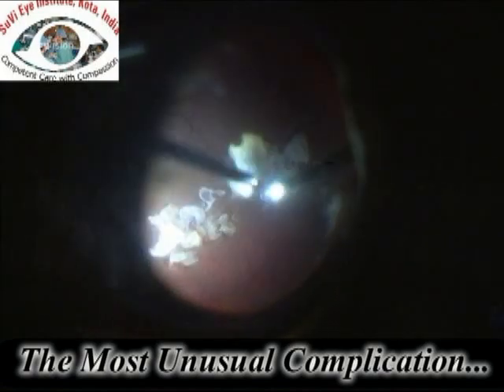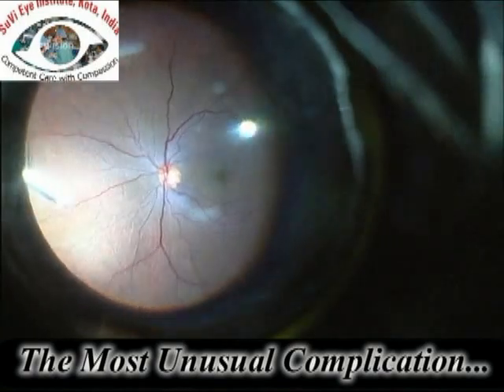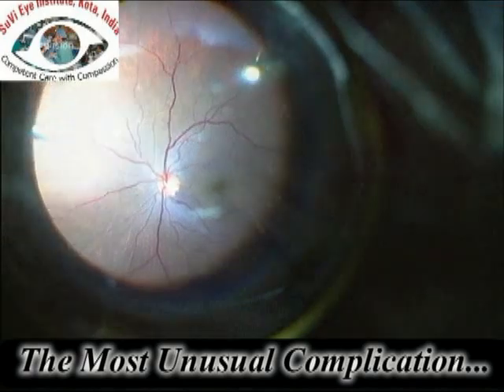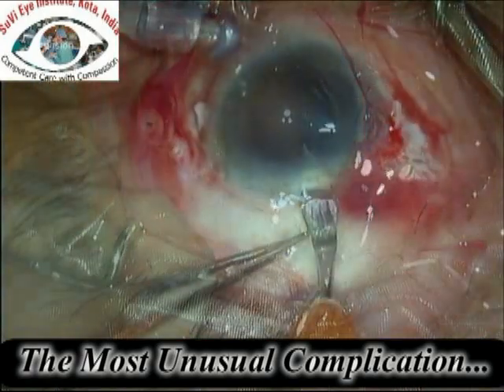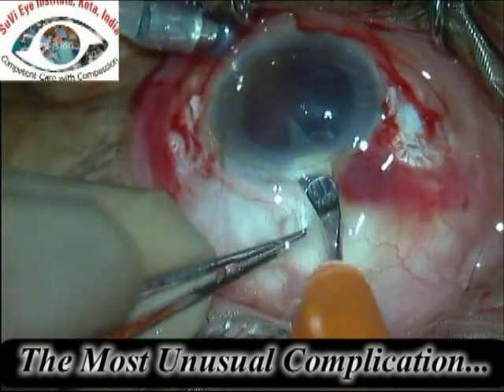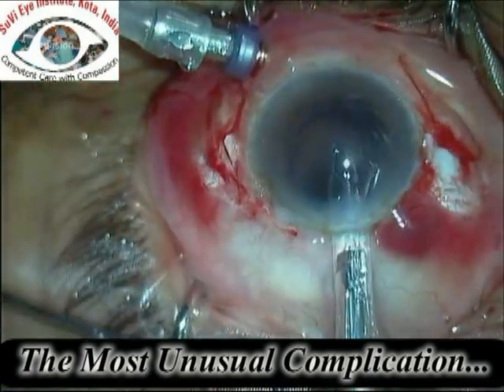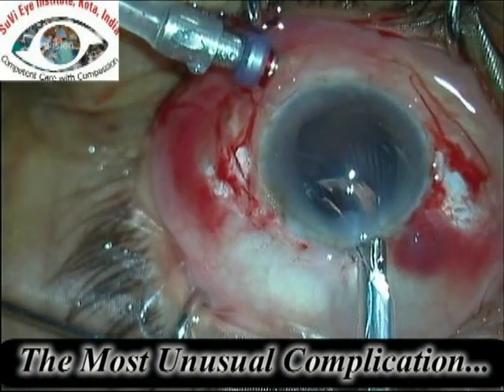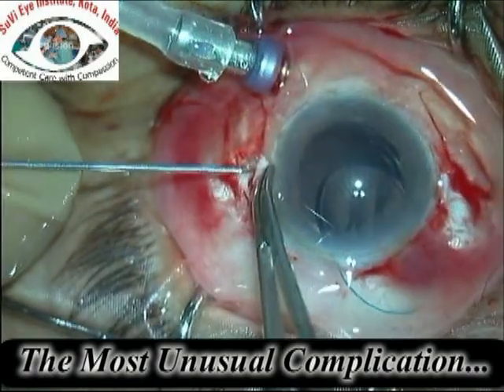The nucleus is now completely free, and a phacofragmentome in the Doc Eva vitreoretinal system is being used to remove the nucleus. As you can see, the retina is completely clear, as is the vitreous, and the nucleus has been very completely and cleanly removed.